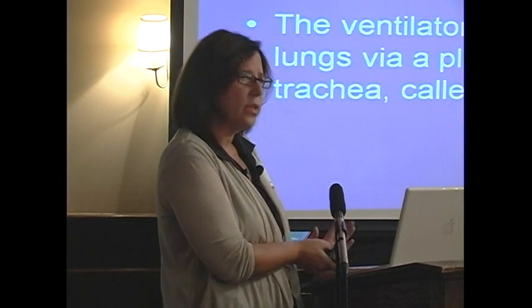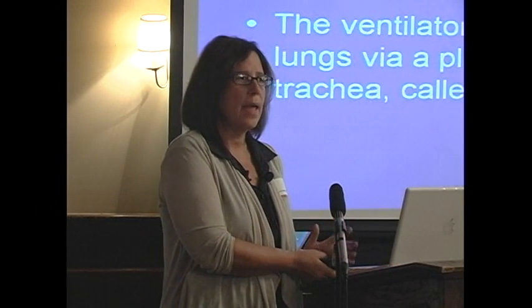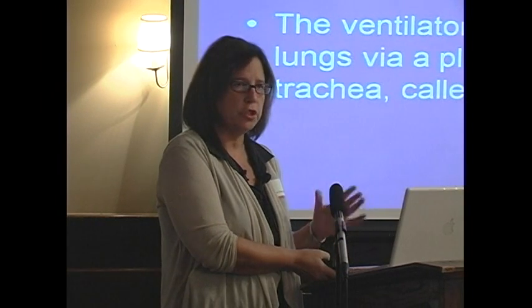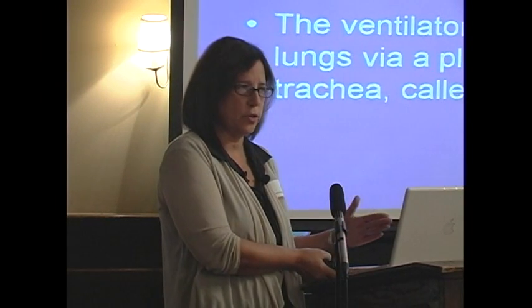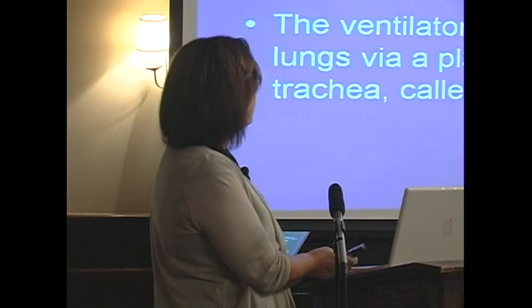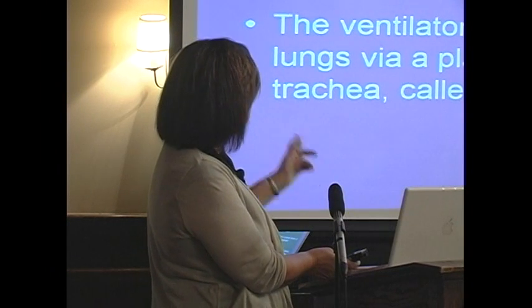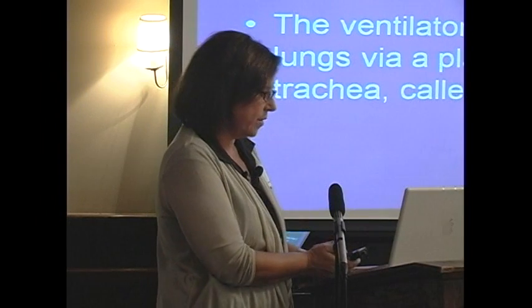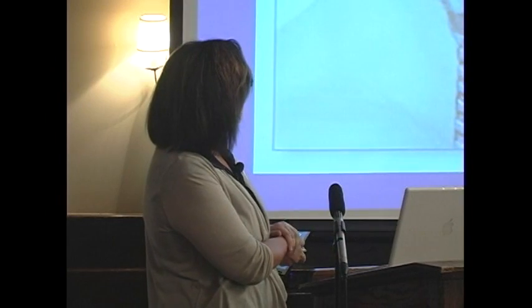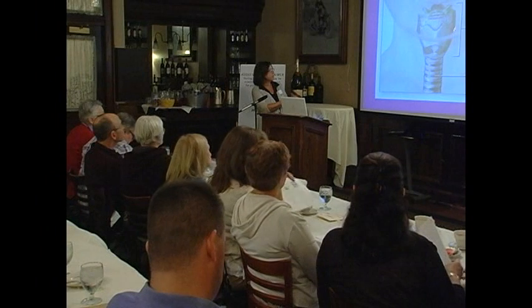I would say that virtually everyone who's using a ventilator for respiratory support has a feeding tube because it's generally not possible to chew and swallow and sustain adequate nutrition without that. So most people have a PEG tube or a feeding tube in the stomach, either beforehand or simultaneously with the ventilator. And as I said, it's connected to the patients via a tracheostomy, and I'm not sure which of these pictures came through. Okay, so just the idea of the tracheostomy, this is just a picture.